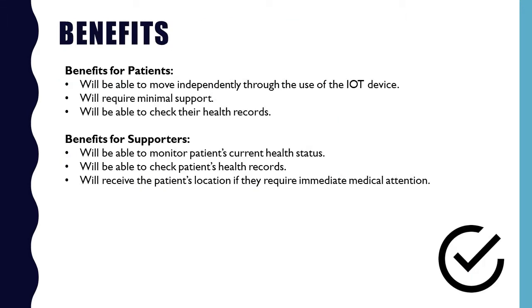Through the use of our iWheelchair app and its few devices, the disabled patient would be able to move through the use of the eye tracking glasses, infrared sensor, pulse oximeter device, and connected wheelchair. The patient would only need minimal support in moving, whether they can use their arms or legs. The only necessary help would be for being placed into the wheelchair, and placing and setting up the app and device.